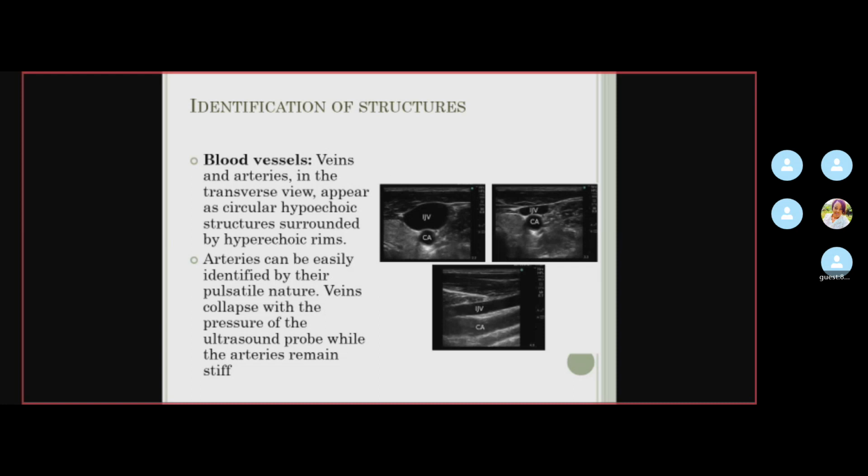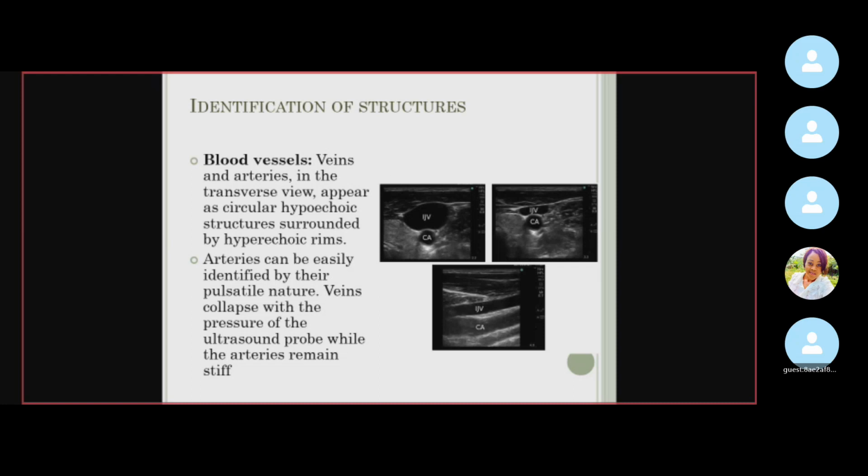So this is a scan of the thyroid part with a linear transducer. There are two orientations which can be taken, either longitudinal or transverse. First, in this picture we see the veins and the arteries. So IJV, that is internal jugular vein, and the second one is the carotid artery. Can you all see this? Yes, madam. IJV and carotid artery. Just beside that, this is the thyroid. A small part of thyroid can be seen.